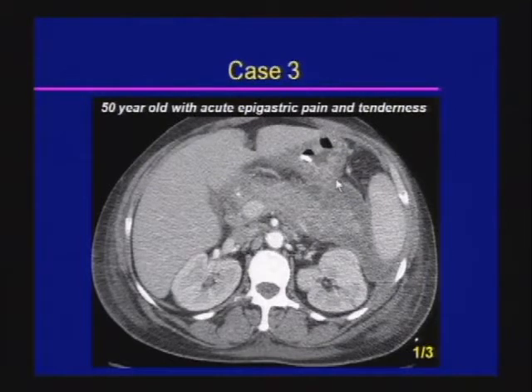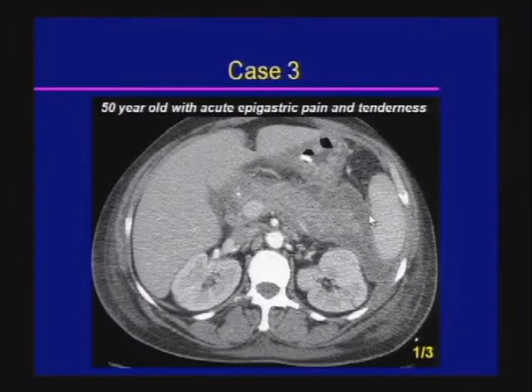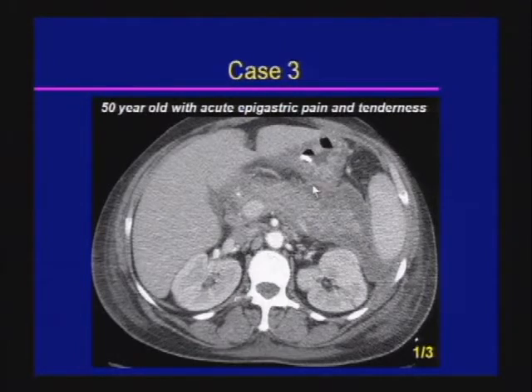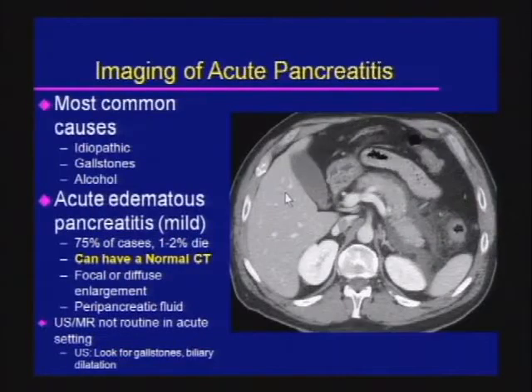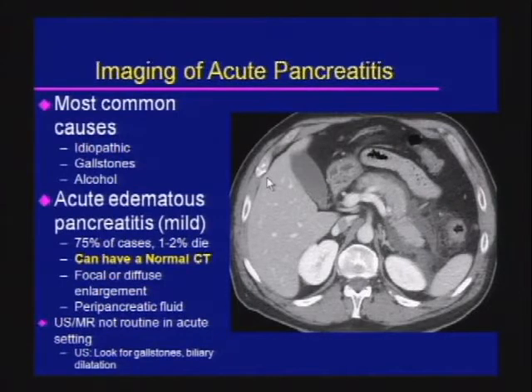Case three: a 50-year-old with acute epigastric pain and tenderness. The pancreas is markedly enlarged with heterogeneity and infiltration into the peripancreatic tissues consistent with acute pancreatitis. The most common causes are idiopathic or gallstones, followed by alcohol, hyperlipidemia, autoimmune pancreatitis, and post-ERCP less commonly.